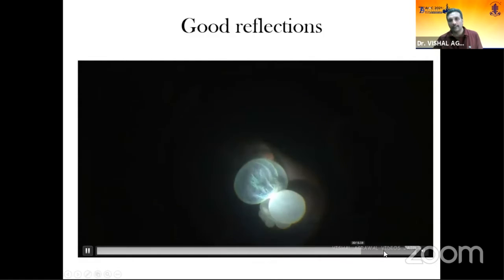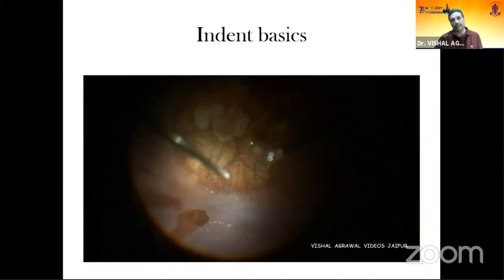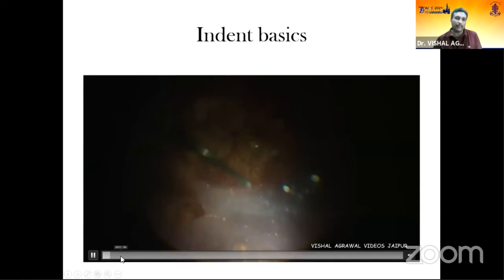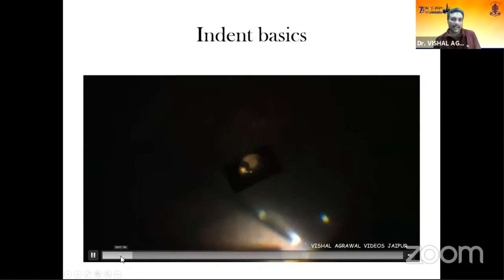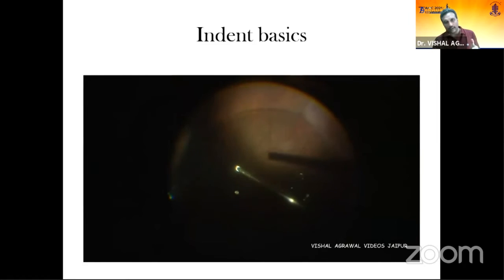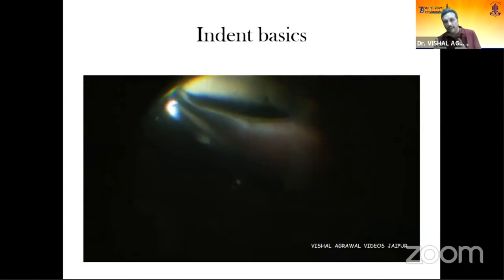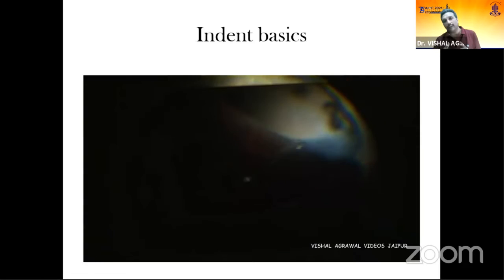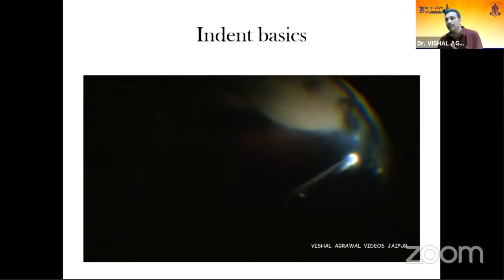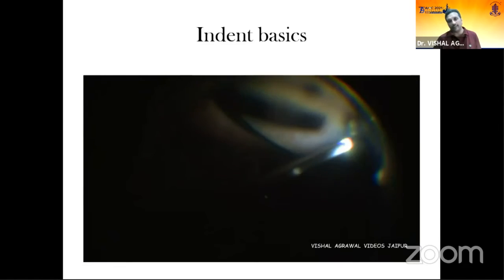After rectifying illumination, you can see every crystal of the triamcinolone acetonide clearly, and the cysts that were not visible in the previous clip are now clear. Recording the periphery is more difficult than the macular part because the light pipe is very near the cutter, causing a lot of reflections and blooming. If you retract the light pipe during indentation and reduce illumination intensity, the periphery and cutter probe will also be visible clearly.